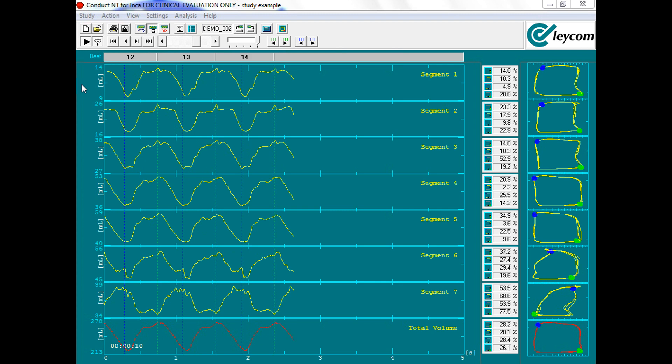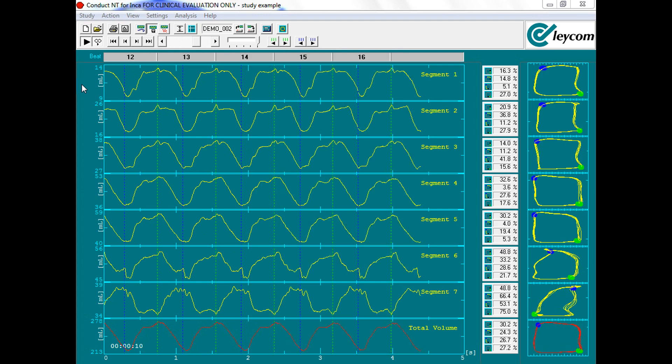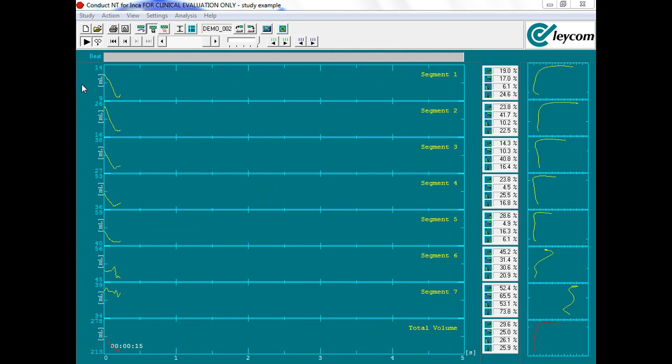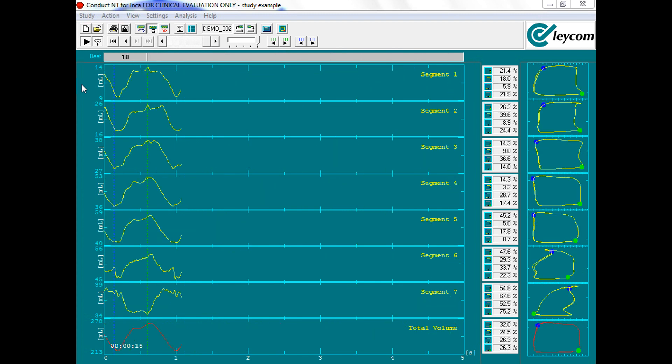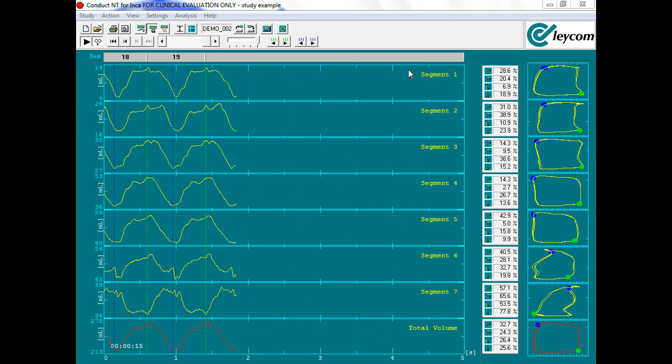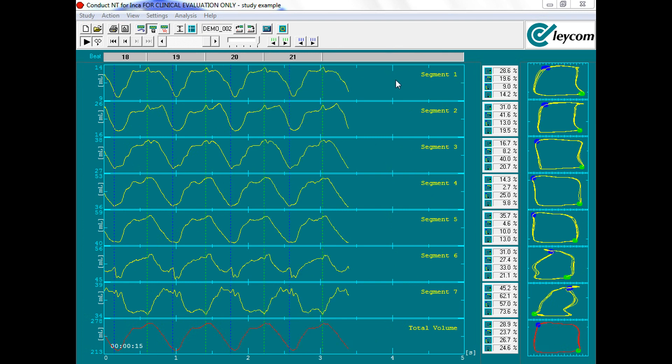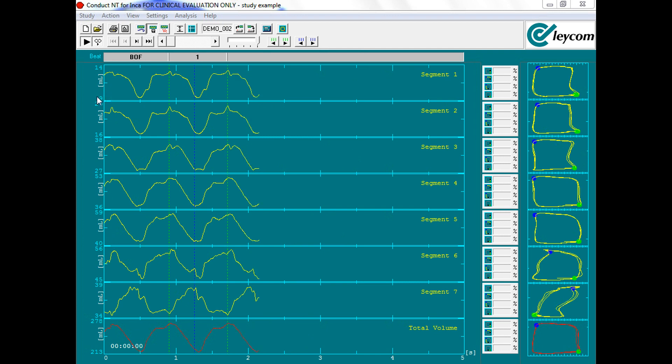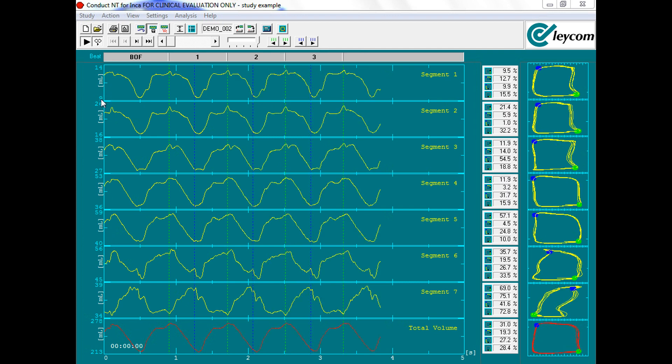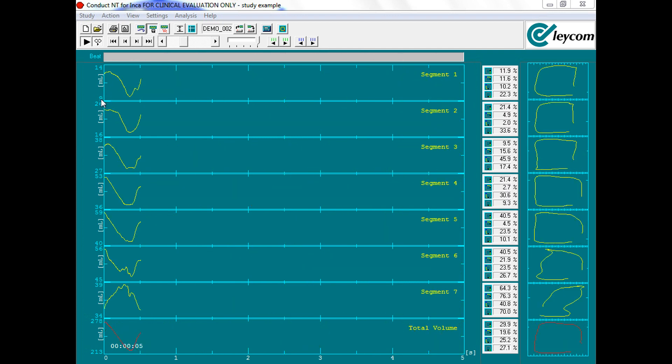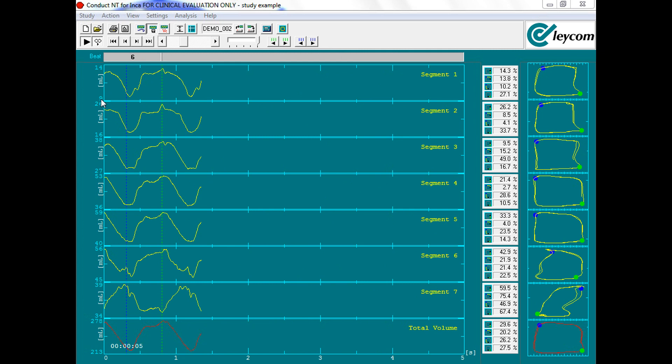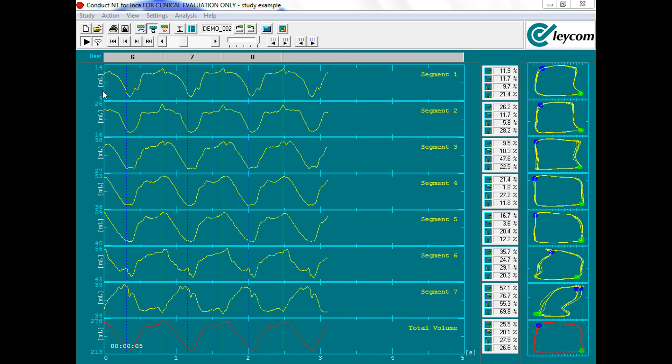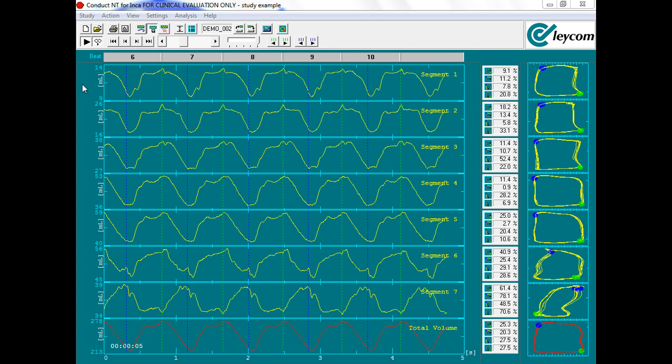In the segmental loops view, we will first determine the depth of the PV loop catheter by looking at segment 1 which is closest to the apex. We'll actually look at the minimum value on the y-axis which is indicated as 9 milliliters here. Typically this value should be around 12 milliliters or less to indicate the PV catheter is delivered all the way to the apex.